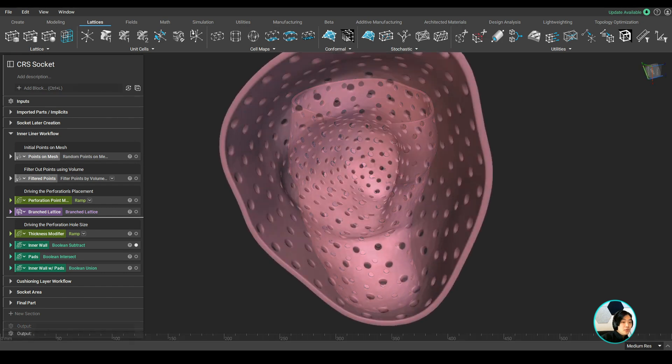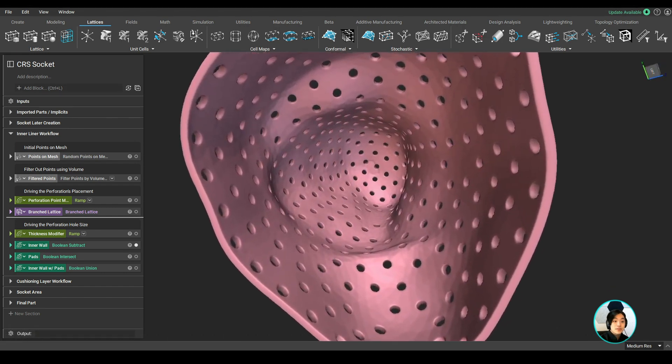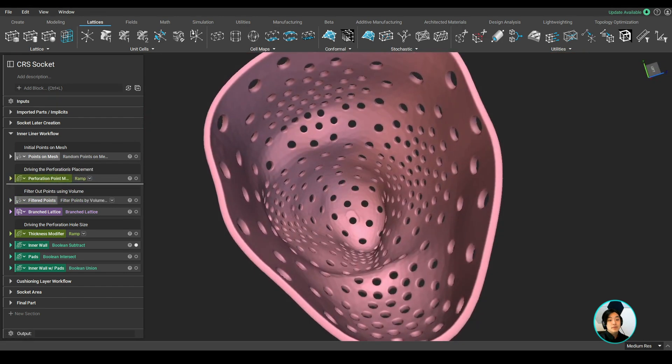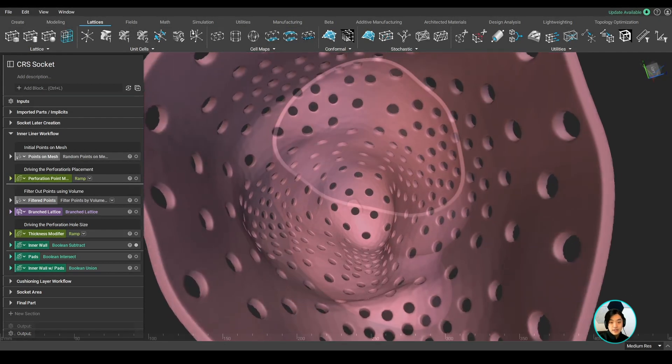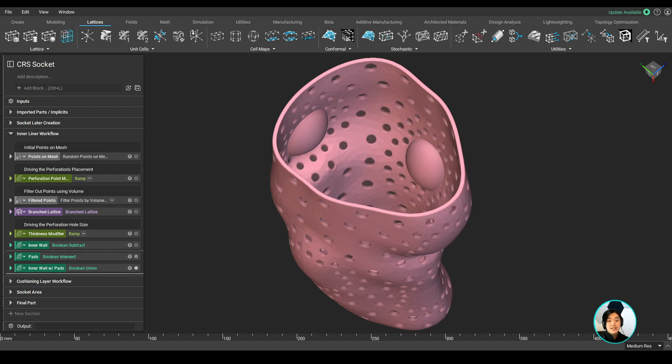Not only can you generate perforations normal to the surface, but you can also drive the placement and size of these perforations around existing geometry. In this case, I used the padding placed on the liner to drive those perforations.